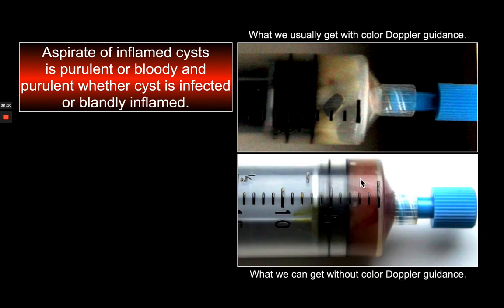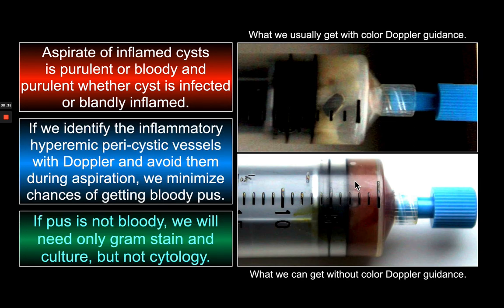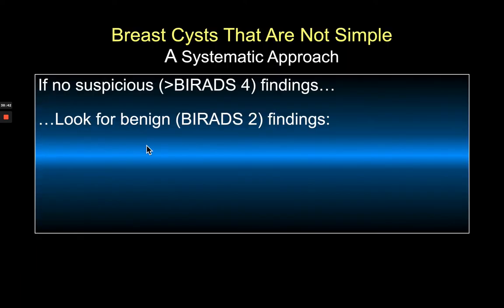Typical pus aspirated from an inflamed cyst can be obtained cleanly using Doppler guidance to avoid pericystic inflammatory vessels, yielding plain yellow pus rather than hemorrhagic pus. If we get plain pus, we only need a gram stain and culture, not cytology or flow cytometry. If we get hemorrhagic pus — from passing through a vessel — we're obligated to run additional analyses for little gain.